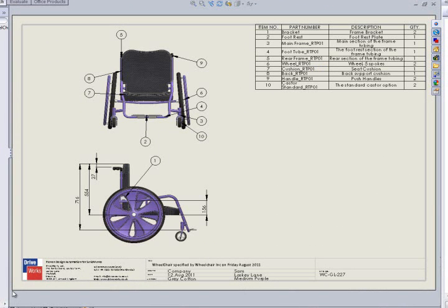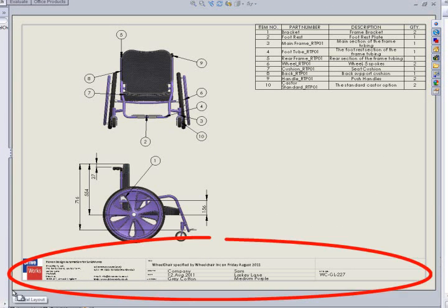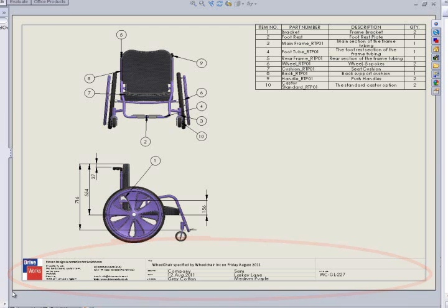The borders have been populated with the information that was entered on the form, such as the company name, the company contact, their address, the color of the frame, the material of the cushion, and the date at which the specification was complete.